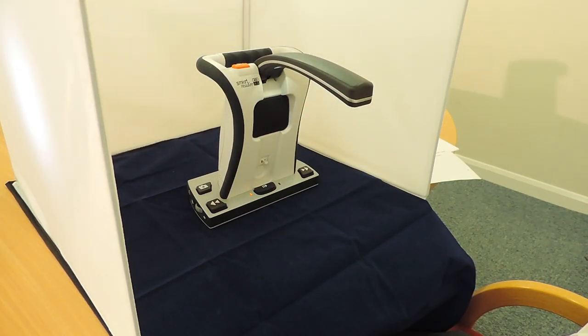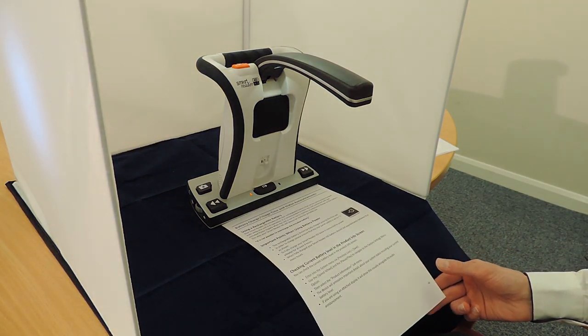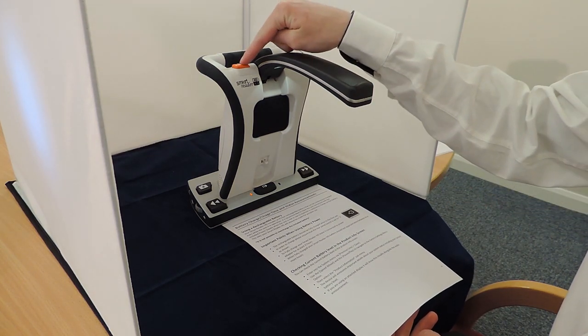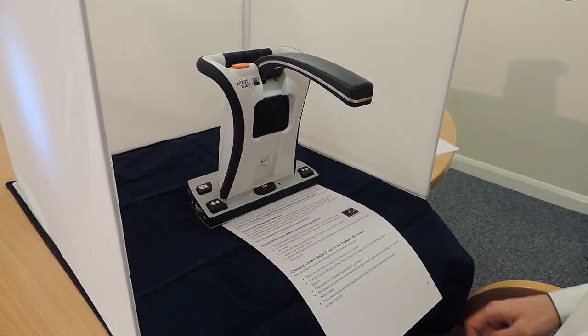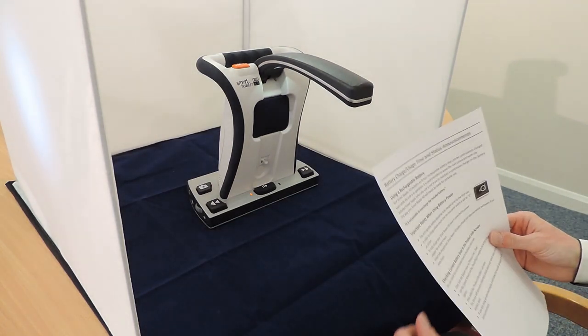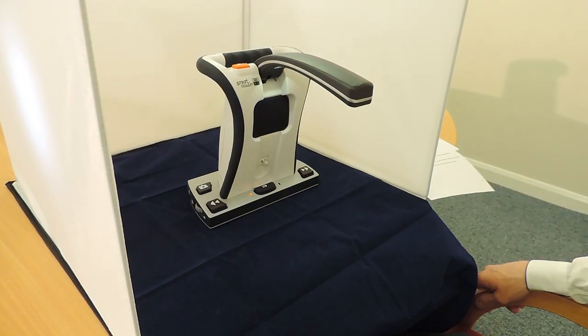To begin, place your document to be scanned underneath the camera. It doesn't matter the orientation of the document, as the Smart Reader will automatically adjust. You can press either one of the capture buttons located on the top of the Smart Reader to perform an OCR scan. Tap again to return to home, ready to scan the next page. The document I placed under the camera was a section of the user guide referencing the battery, and using the OCR technology, this has now been read back to me quickly and accurately.